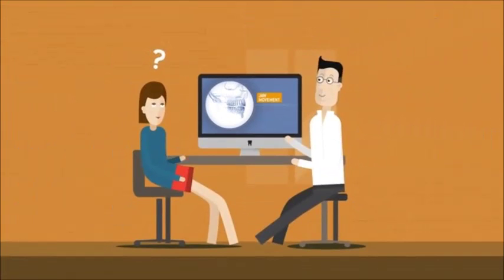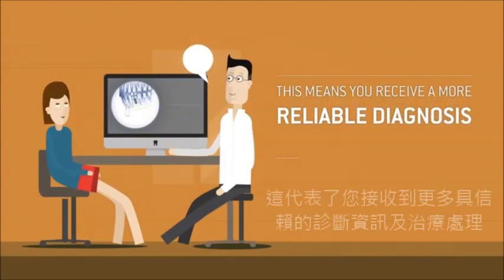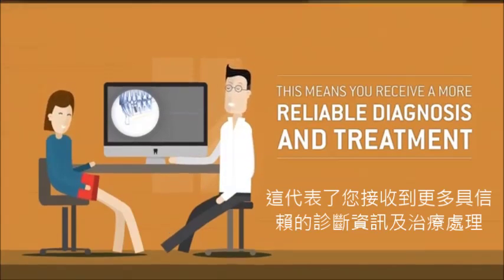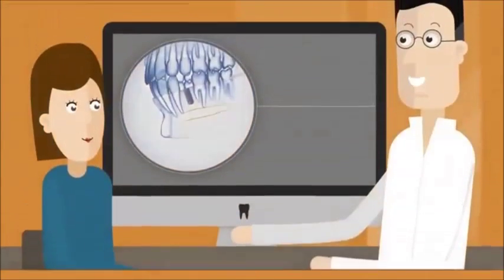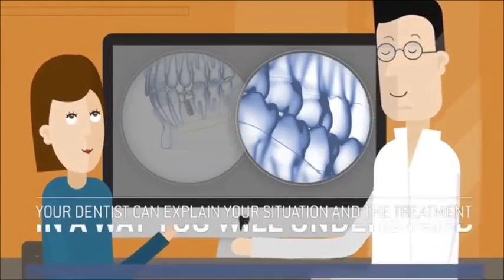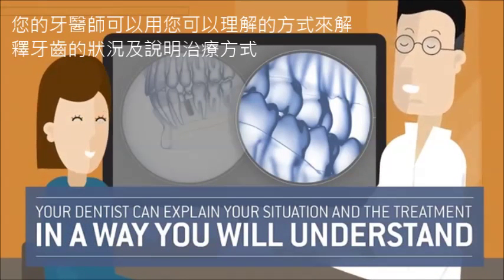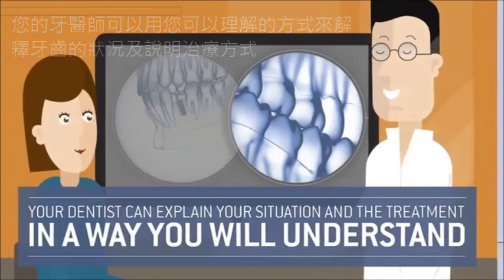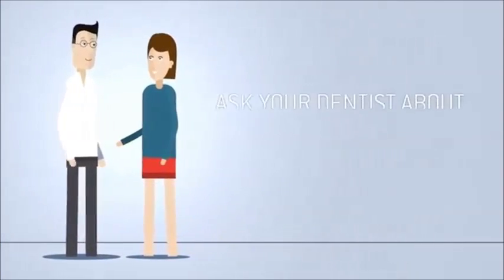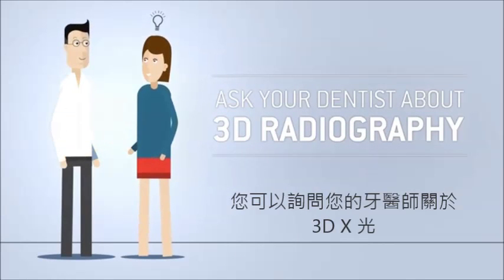For you, this means not only new examination options, but above all, more reliability when the problem is diagnosed and during the treatment itself. Furthermore, your dentist can show your complicated situations to you much more easily and explain the treatment process in a way you'll understand. These are all the benefits of 3D radiography. Ask your dentist.